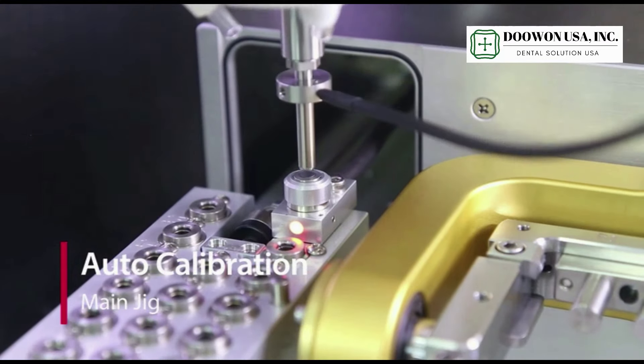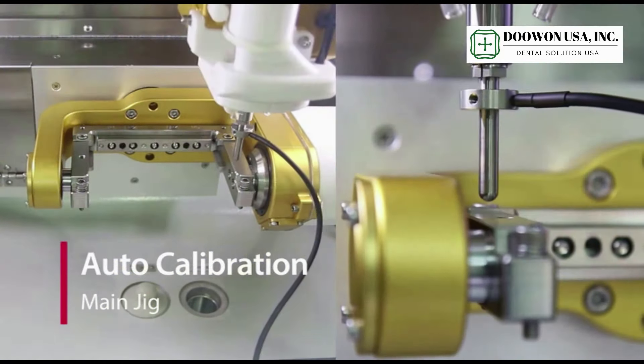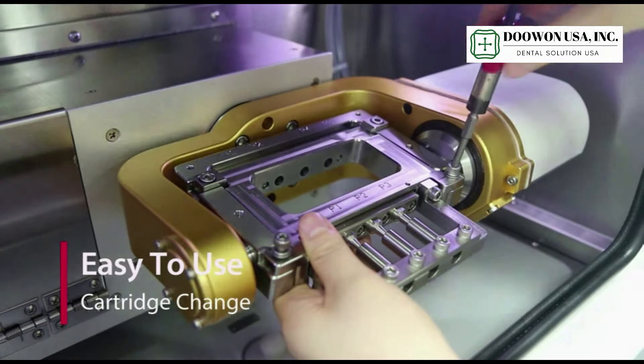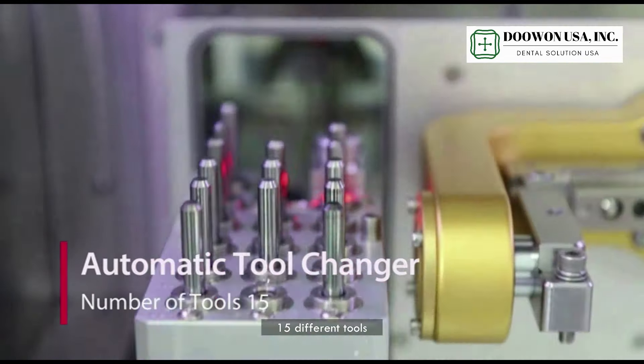Auto calibration. Cartridge changes are easy to use — it is really simple. Automatic tool changer with 15 different tools.